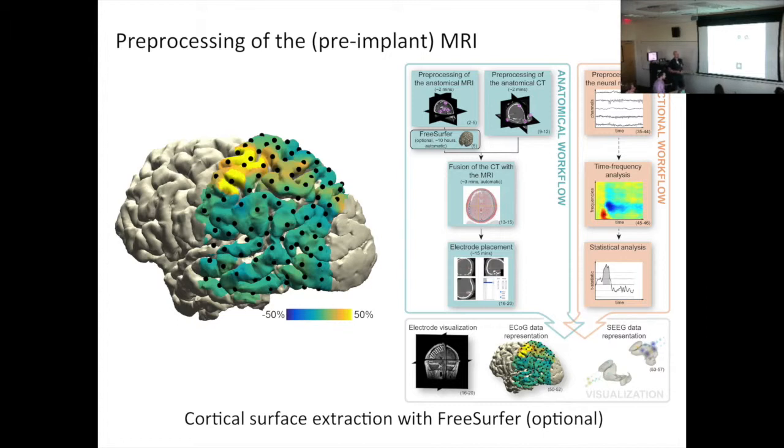Then the posterior commissure. Another white tract that connects the hemispheres. And finally, the midline point. OK, so you want to check in your command window that you've got coordinates for all four landmarks. And when you do it, you can close the figure and your scan is now in the ACPC coordinate system. OK, you can now give your scan to FreeSurfer. It's optional but recommended. One of the benefits of FreeSurfer is that it creates these very nice pial surfaces. It's great for visualizing data.